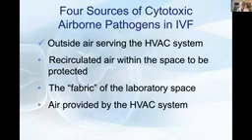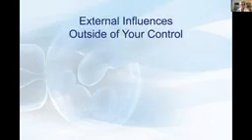Most IVF laboratories, no matter where your location, have 4 common pathways in which the air contaminants can enter your laboratory and impact the culture environment. Your outside air, the recirculated air within the laboratory, the fabric, as we call it, of the laboratory space, the construction materials, and then the air provided by the HVAC system itself, the ductwork, which is often not paid attention to.